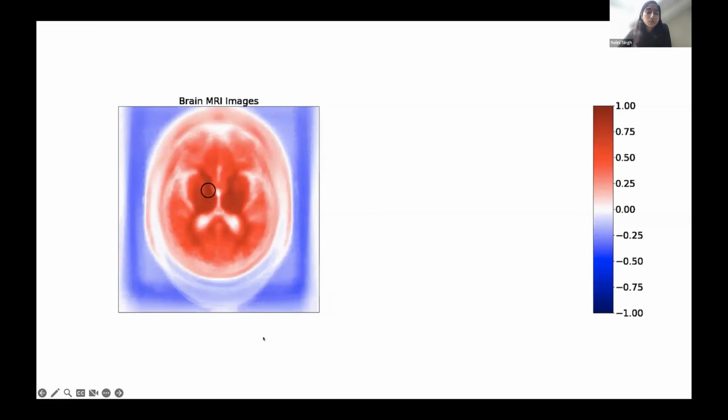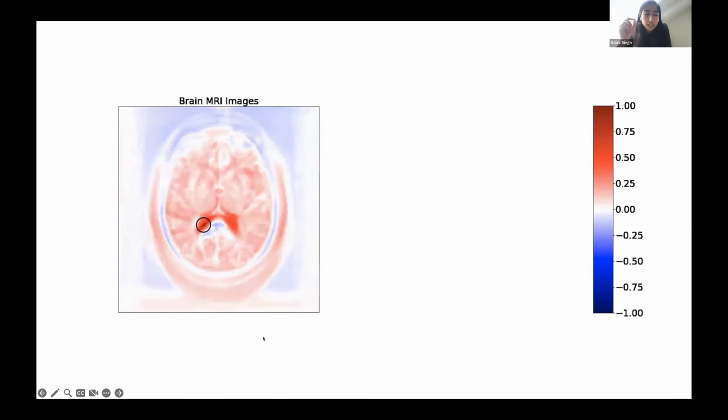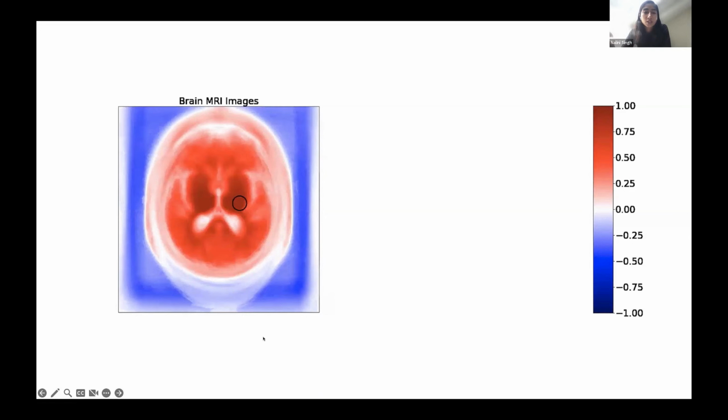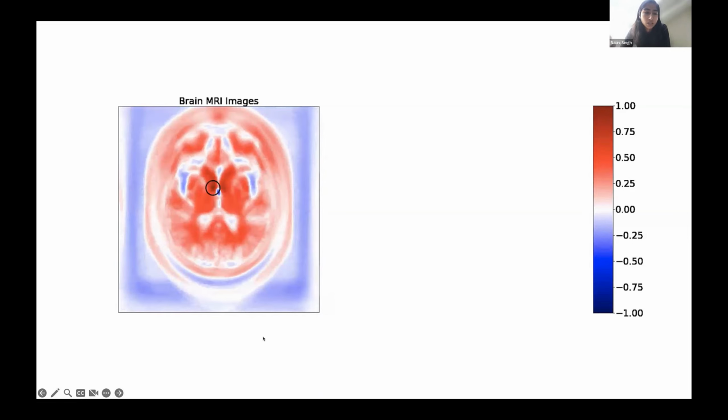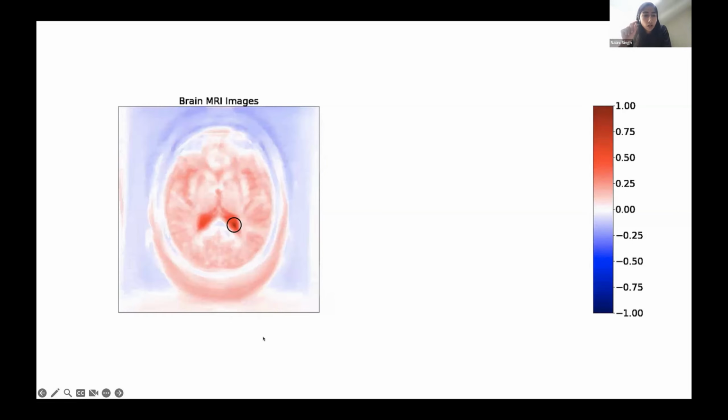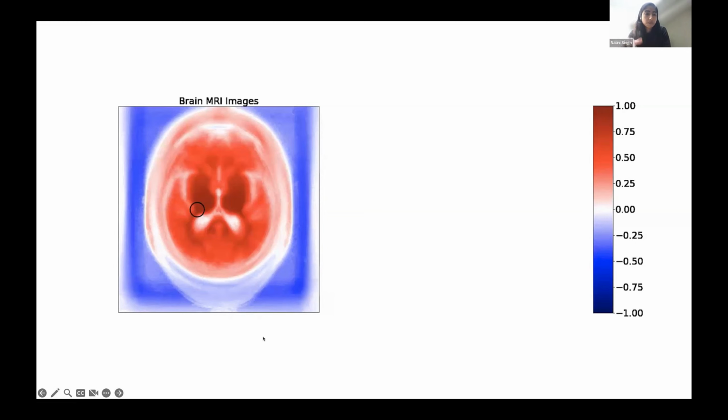And if you think about it, this is a pretty intuitive result. All this is saying is that locally, we expect pixels that are next to each other to be highly correlated with each other. So pixels that are next to each other are likely to be similar, probably because they belong to the same structure in the image. And this is the correlation that we think standard image space convolutions are typically capturing. So you normally have these local convolutional filters, which operate on really small patches and capture this correlation structure.